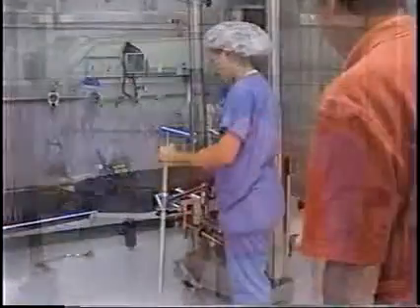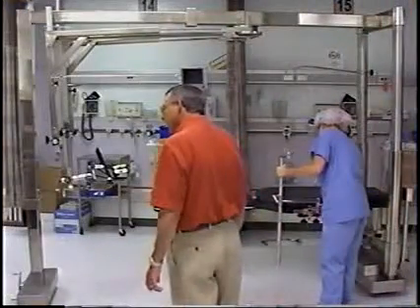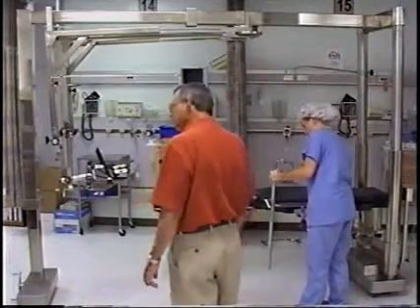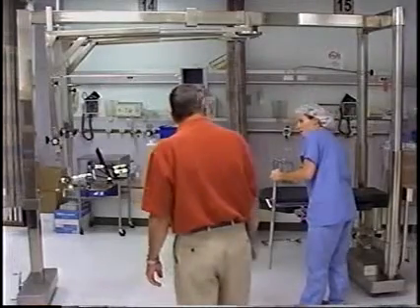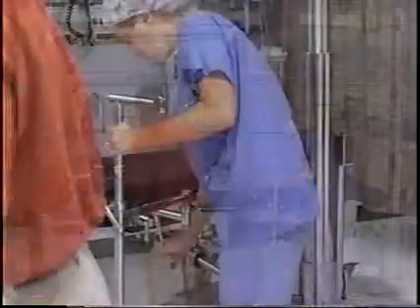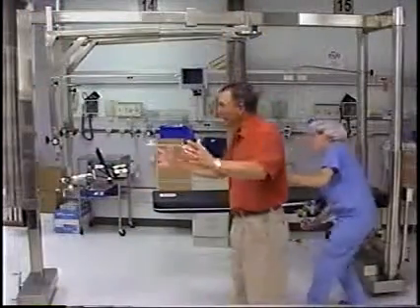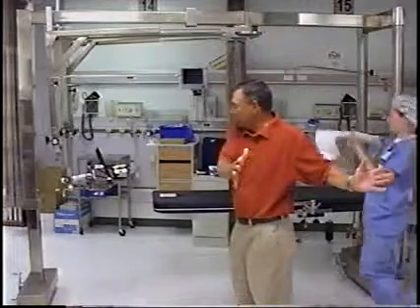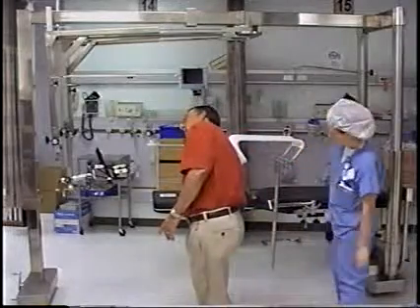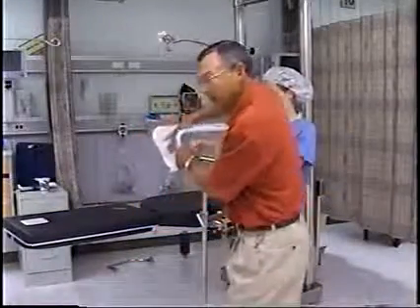Okay? Is there a certain angle that you put your unaffected leg holder at? Because, I mean, look at all those different joints. Remember, all you're doing is supporting the unaffected leg so you can abduct it out of the way. The thing that you have to be most aware of is making sure you don't have pressure along that popliteal space in the back. That's the reason you've got a soft pad here.